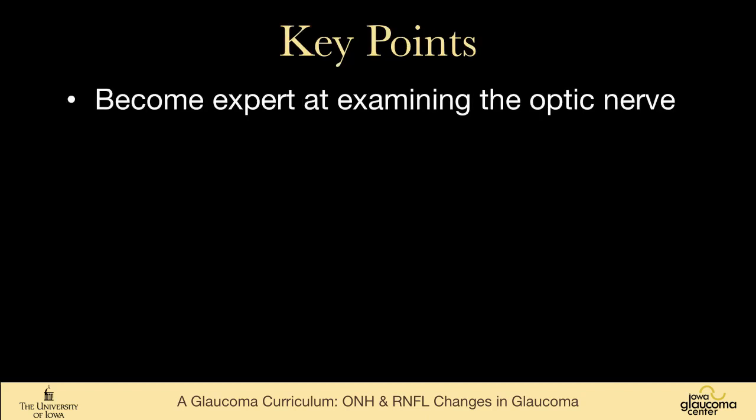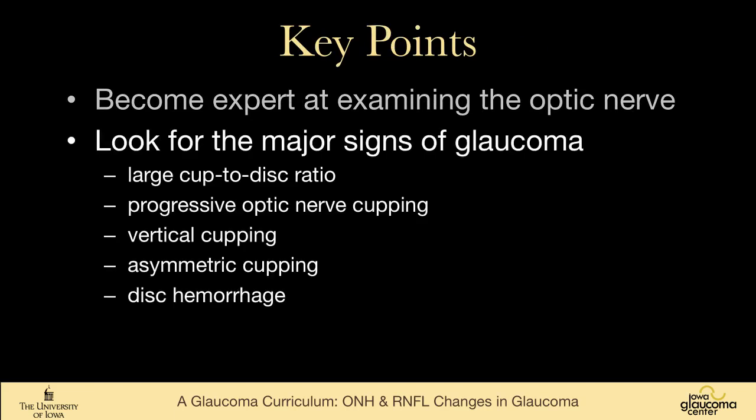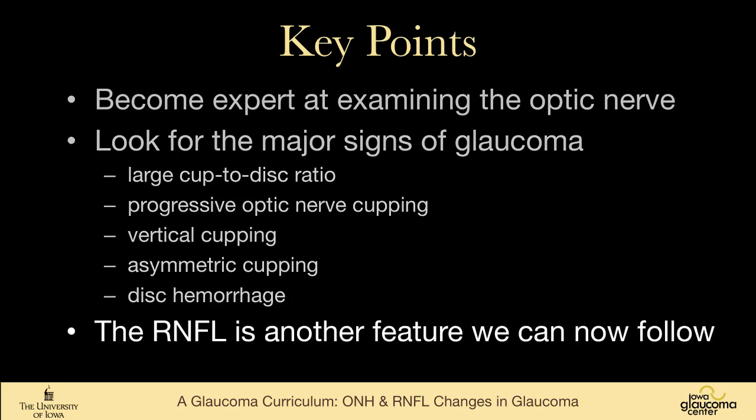So a long talk, but the key points are that you should become an expert at examining the optic nerve, looking for the major signs of glaucoma: large cup to disc ratio, progressive optic nerve head cupping, vertical cupping, asymmetric cupping, and disc hemorrhage. And now, thanks to new technology, the retinal nerve fiber layer is another feature that we can follow. In whatever device you have at your institution, you should become comfortable and expert at using that.